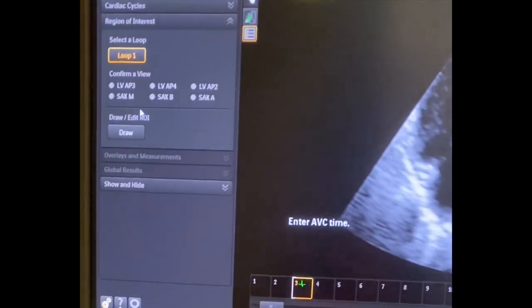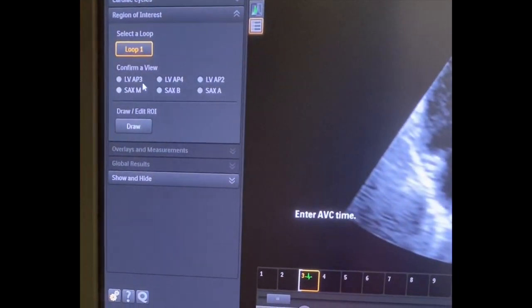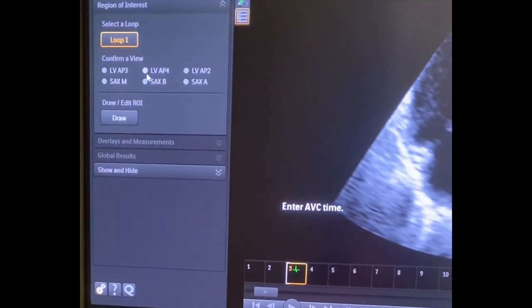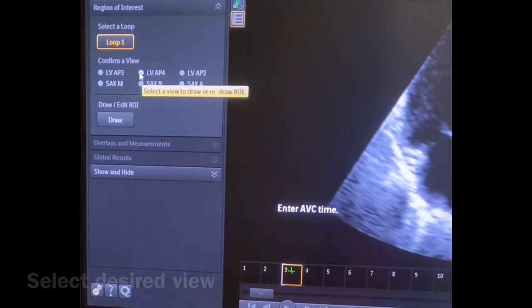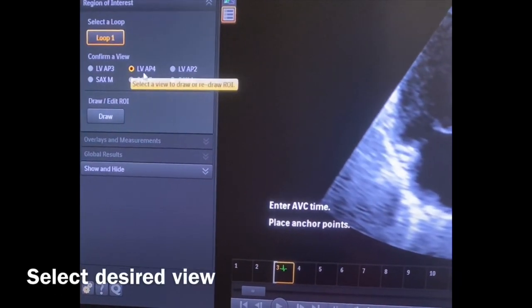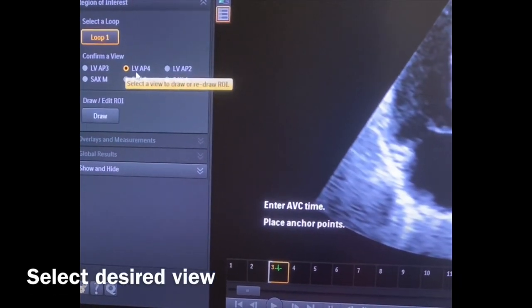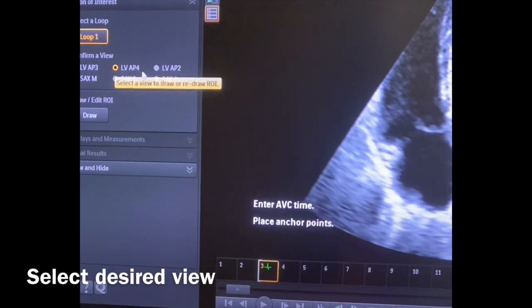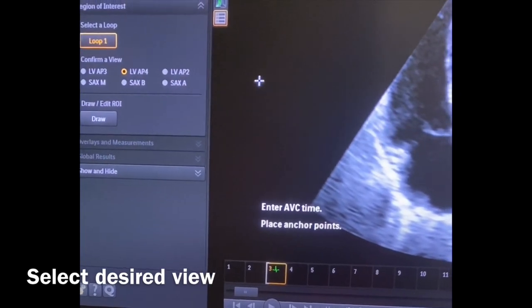You have to come over here to the left of the screen and select which view you're in. Since we're on the left ventricle of the Apical 4 Chamber view, that's what you need to select.